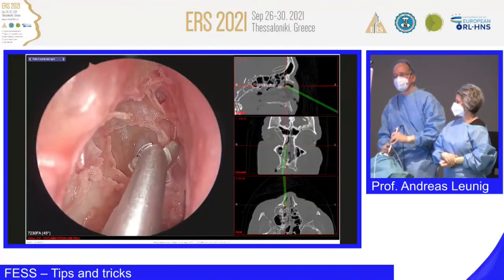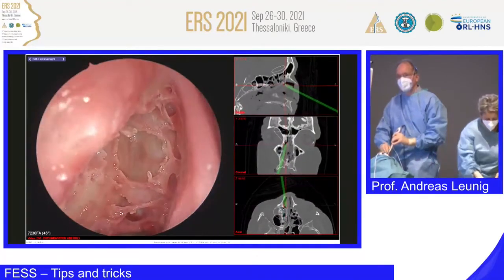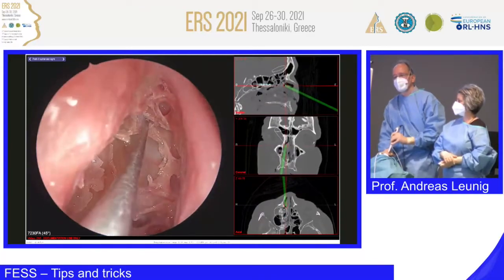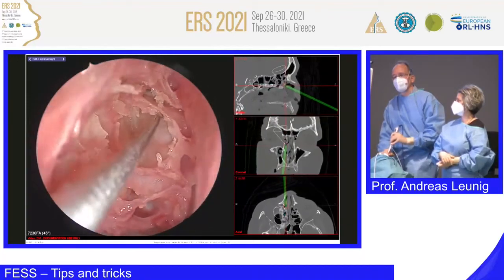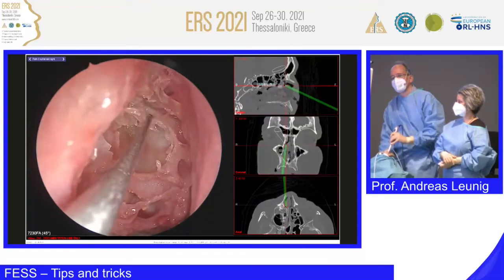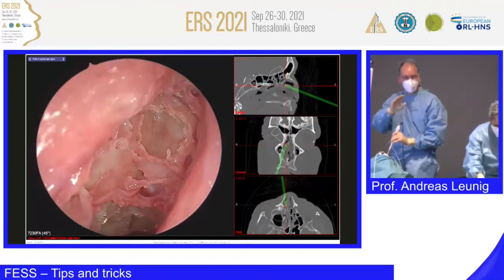Give me, please, the Castelnuovo probe. I think that's a tricky frontal. Terzis, huh? I'm not sure if we can go here. You think that's the right way? Oh, can you see it here? Is it skull base? Thank you. Oh, it's a relief for me. No, it's okay.